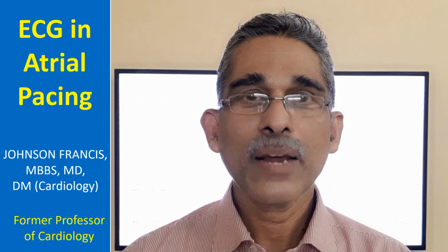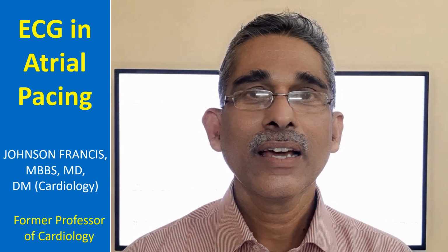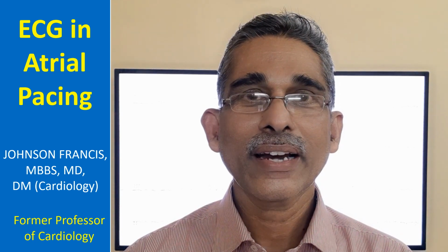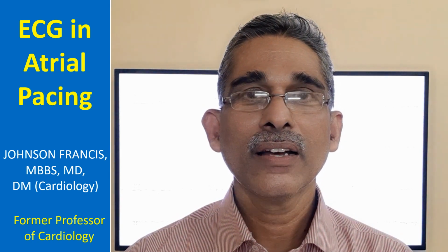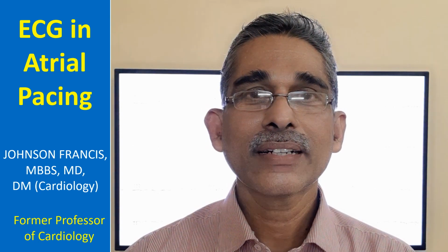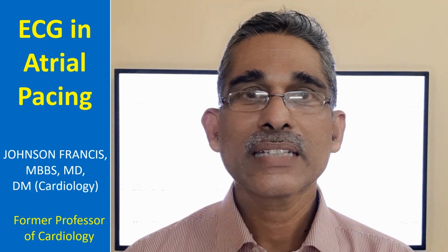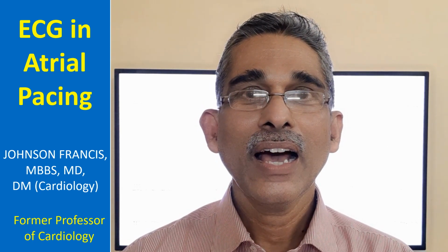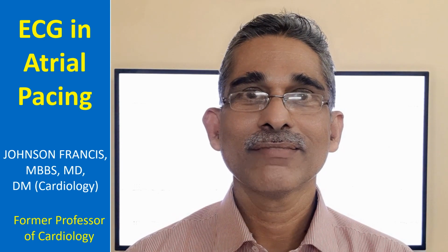Ventricular pacing can produce dyssynchrony of the left ventricle and can cause left ventricular dysfunction in the long run. So there is an advantage in pacing the atrium alone. But the disadvantage is that if AV conduction disturbance occurs later, you will need a pacemaker revision.